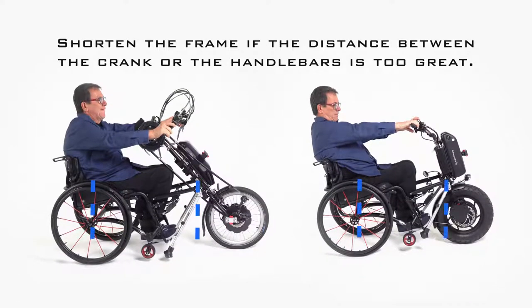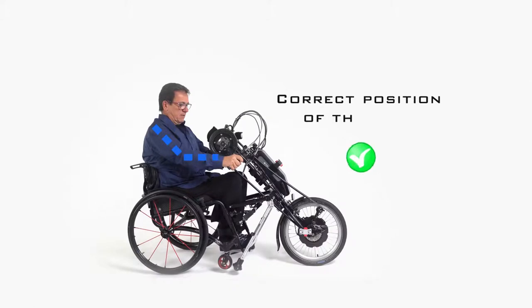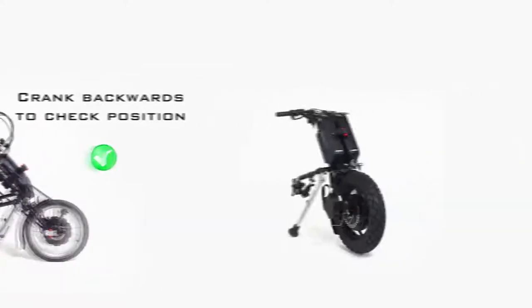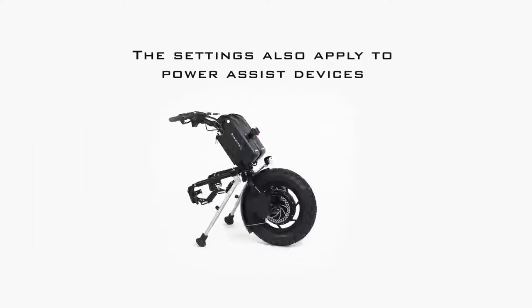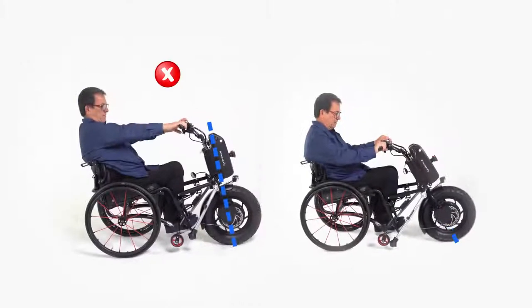If the unit is too far away from the rider, the frame can be shortened. Make sure that the arms are still slightly bent at the maximum crank distance. The back should be leaning against the wheelchair, and the pivot point of the cranks should be at shoulder height. Crank backwards a few times to test the settings. These adjustments can also be done in exactly the same way with a power assist device. Also make sure the angle of the fork is not too steep.